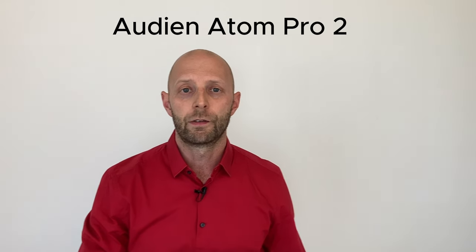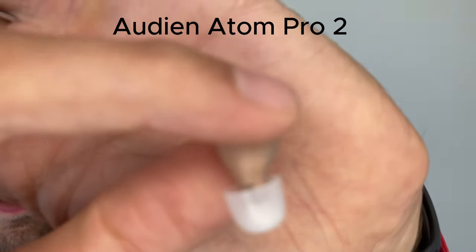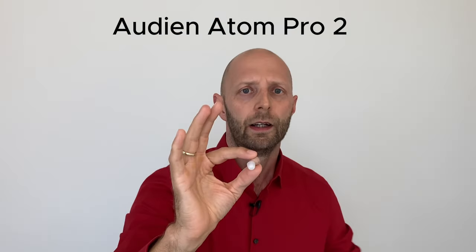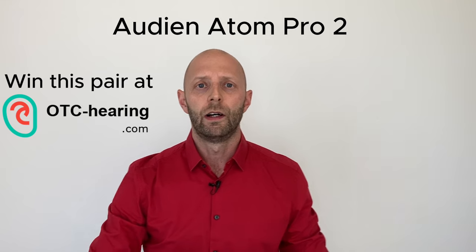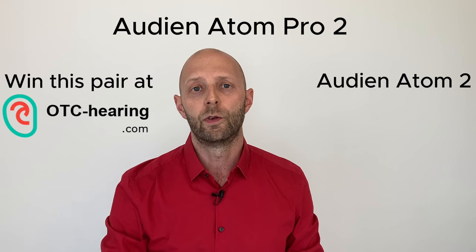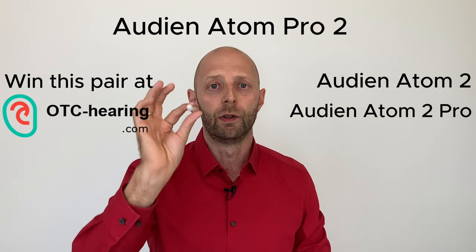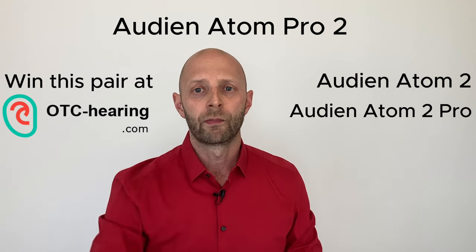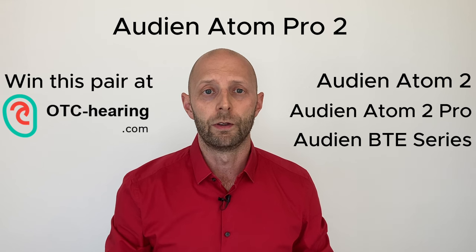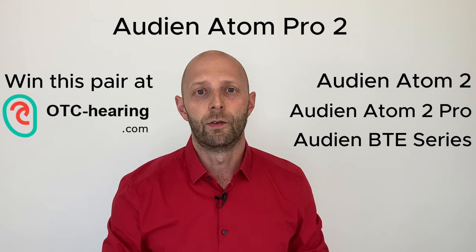The Audion Atom Pro 2 is a very small in-the-ear hearing aid. Audion now has three different hearing aids: the Audion Atom 2, the Audion Atom 2 Pro — the bigger brother of the Atom 2 — and also a behind-the-ear device which is new. But let's stick with the Audion Atom Pro 2 and check what's in the box.